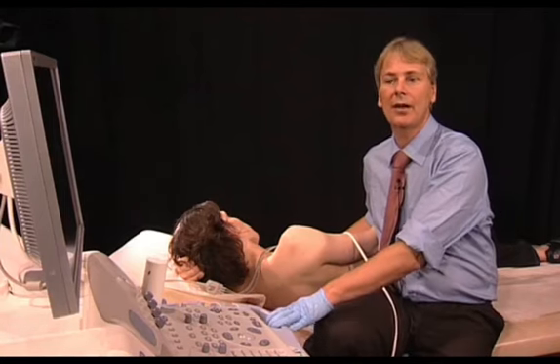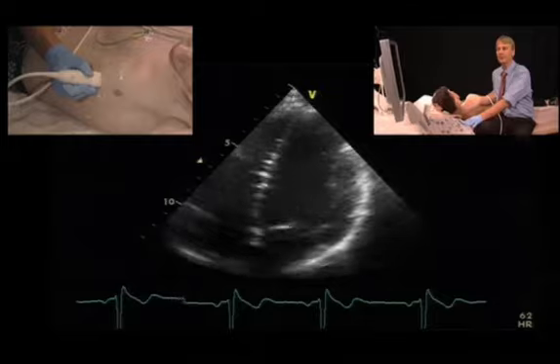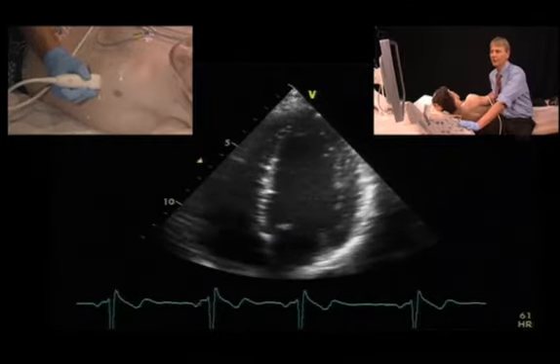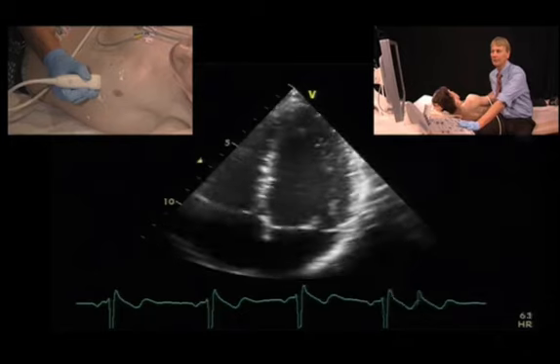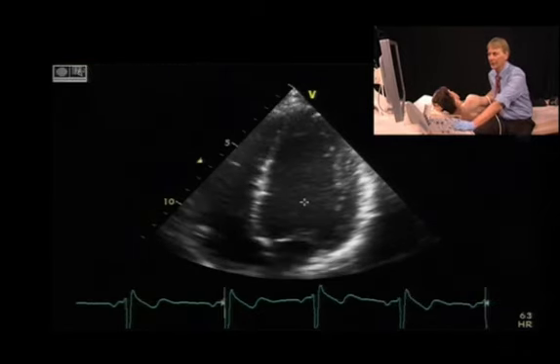2D measurements of the left ventricular diameter are quite simple and easy to do. I'll just show you how one can perform this measurement. First of all, use a 4-chamber view, freeze the image at end diastole, and also consider that the endocardium is located more medially, and that this is not the endocardium here, but that this is the endocardium.